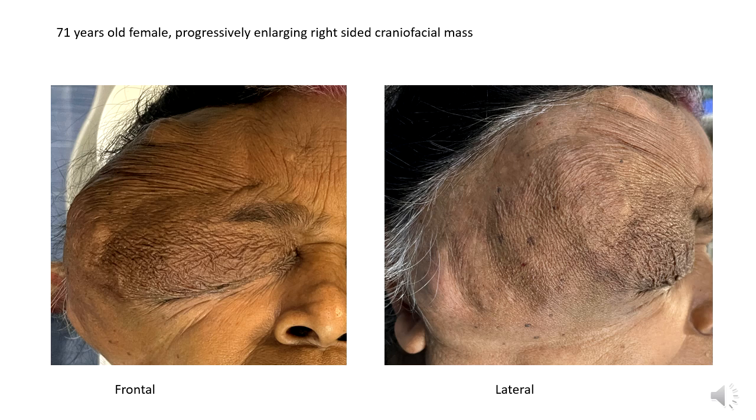under general anesthesia. The surgeons plan to take out the entire tumor, but possibly a part of the tumor involving the lid could be left behind, if it is found difficult to operate it out surgically. The embolization was planned using our combined technique, as I have already discussed, that we use direct puncture embolization with glue and combined with transarterial microcatheterization and embolization with PVA particles.